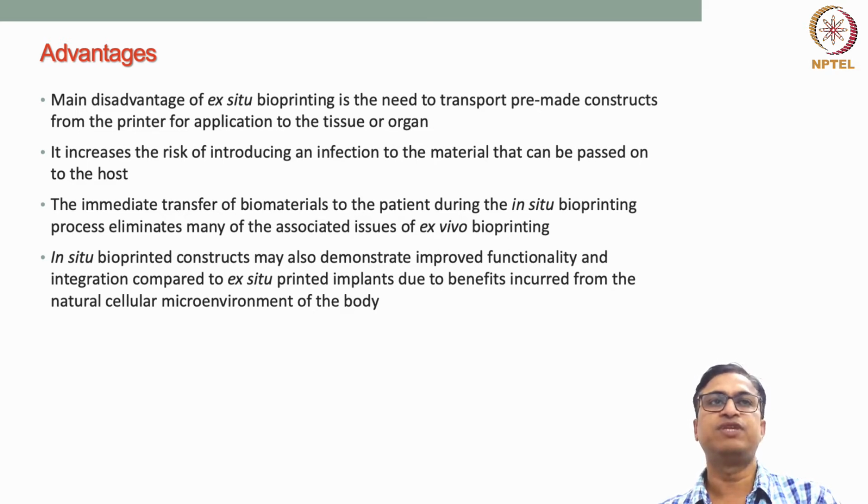So we need to be very cautious about this. But when we deal with in situ bioprinting, because this process transfers the biomaterial directly to the patient's wound bed, it eliminates many of the associated issues of ex vivo bioprinting. The fabrication is directly on the wound bed, so there is no requirement of prefabrication time, and the process becomes one step where we can print directly on the wound bed.